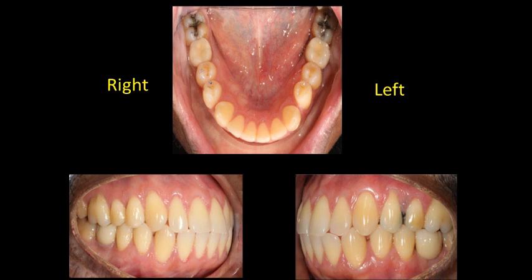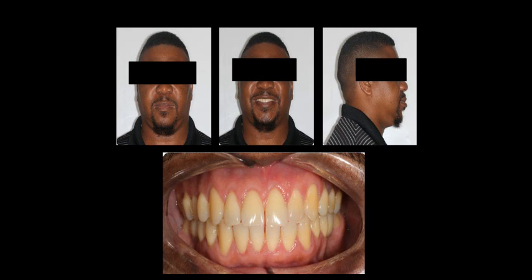And the occlusal view of the lower, and the right side and the left side, and we have done this patient a tremendous favor with a minimal amount of treatment. And this is the way our patient looks, not smiling, smiling, and the profile.